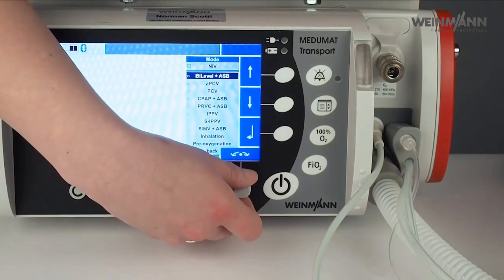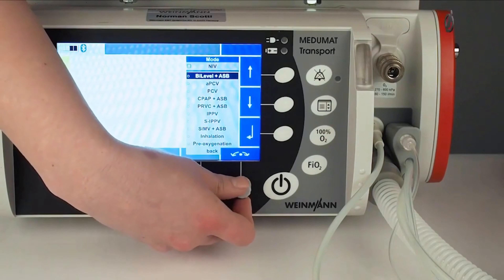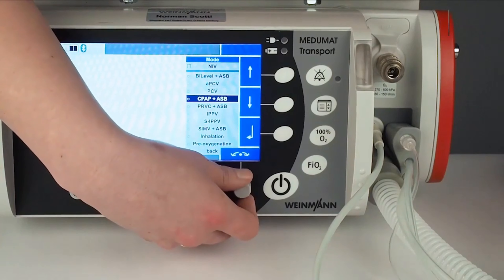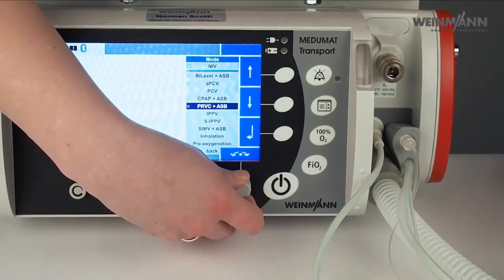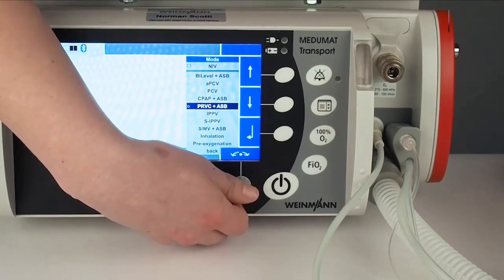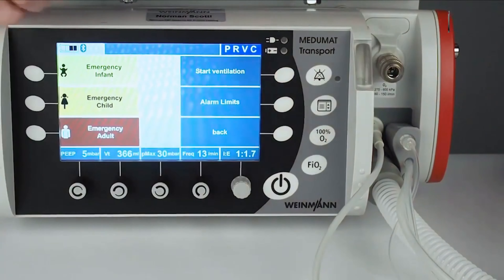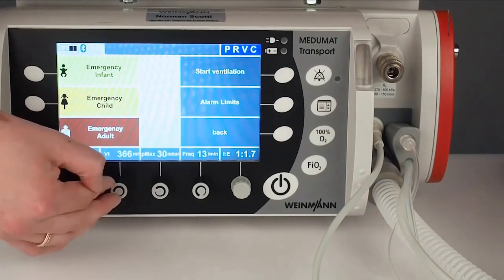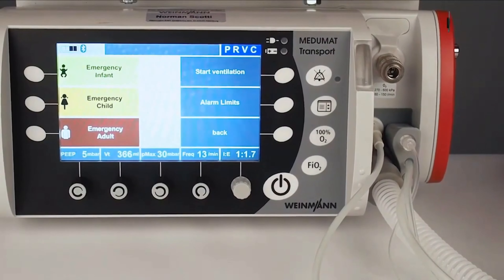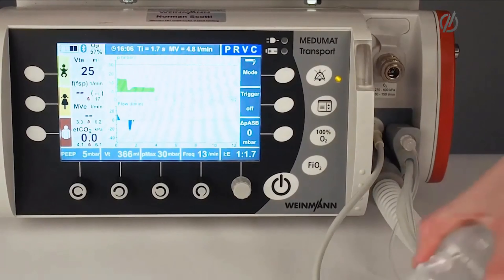Now I can choose my ventilation mode. There are different ventilation modes: some pressure-control ventilation modes like bi-level or bi-PAP, assisted pressure-controlled ventilation, or CPAP/ASB — ASB is pressure support — or a pressure-regulated volume-controlled ventilation mode. I will choose this one. Now I can start ventilation. You see all the parameters: the device has calculated a tidal volume of 366 milliliters and a frequency of 13 from the patient height. Start ventilation by pressing here.